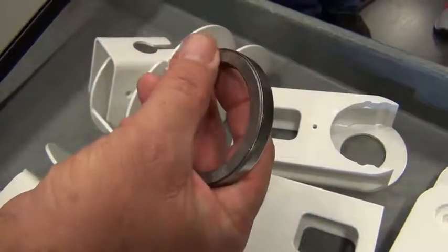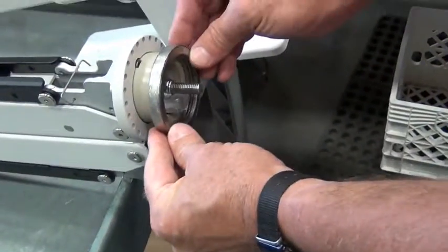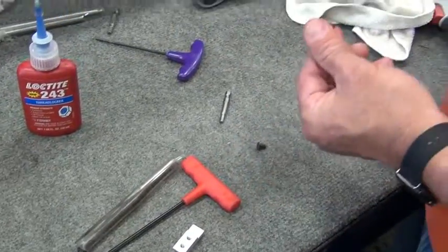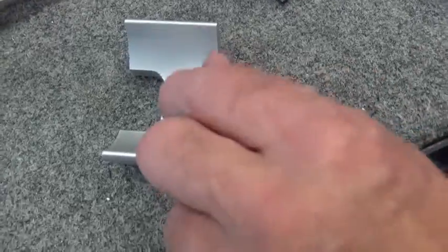A 3-inch bearing slides over the brake sleeve. The widest race faces outward so it will sit flat on the wall ear. The end cap is assembled using two 10-24 by 3/8 inch flathead socket cap stainless steel screws.